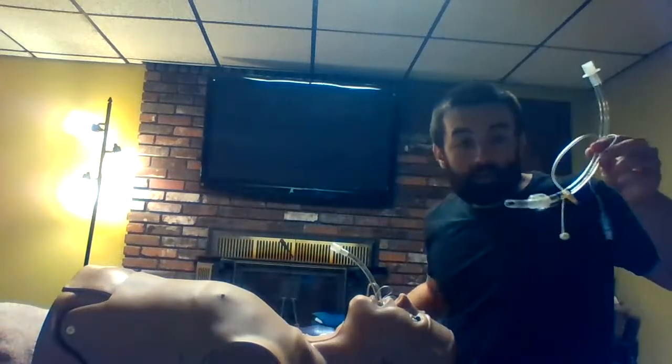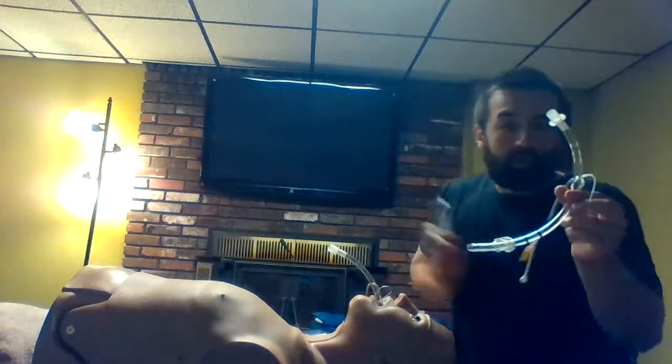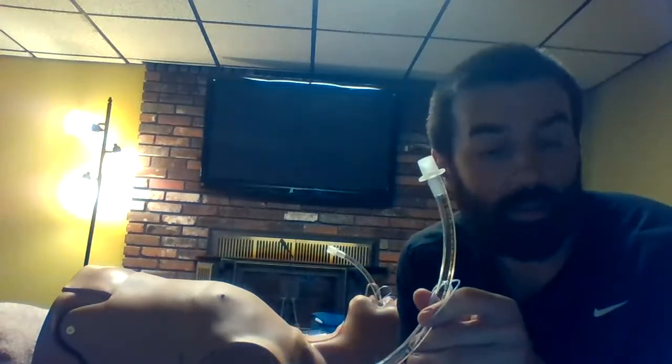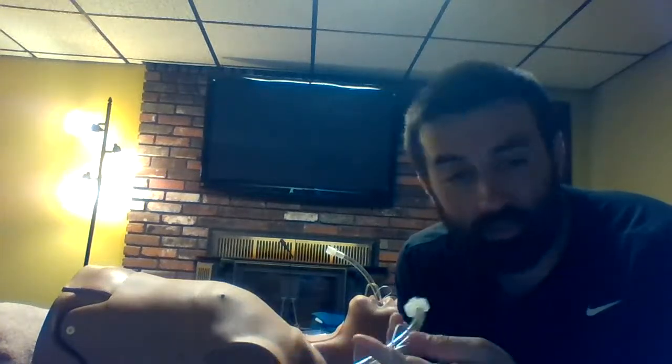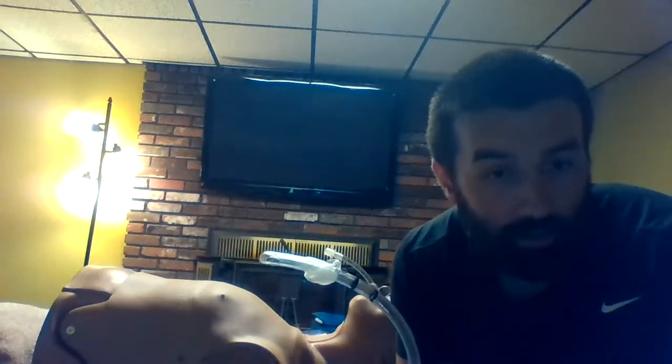Usually at this point, you could trash this thing, but what I like to do is I always want to know kind of where the leak is and see if it was something where they nicked the pilot balloon or pilot line and I missed it, or if it was indeed a cuff rupture. Usually you can't tell because air is not visible, but if you put this in a little basin with water, draw some air back, hook it up to the pilot balloon, lay it in water and push through, you'll see bubbles from wherever the rupture is. And in this case, you got a little bit of a micro tear on our cuff.